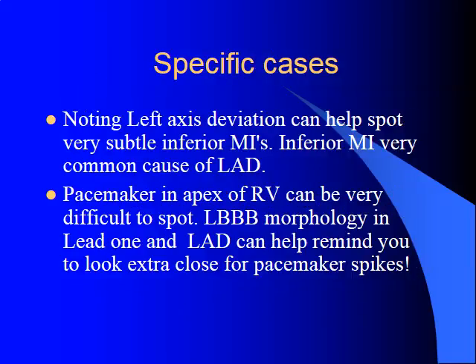Noting left axis deviation can help you spot really subtle inferior MIs whenever you have a very small amount of ST elevation. It makes it easier to remember to look for that ST elevation when you do see the left axis deviation.